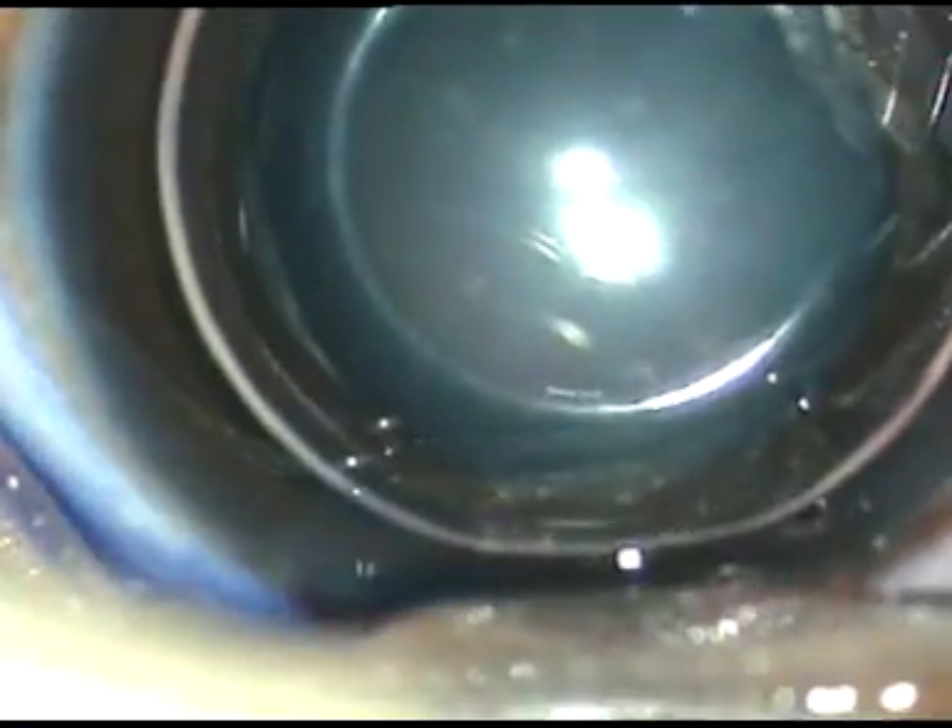If we use air bubbles, the undiluted dye rests on the anterior capsule and staining occurs in a very short time. In this case, I have waited for about 10-12 seconds. And now I am washing the dye out.